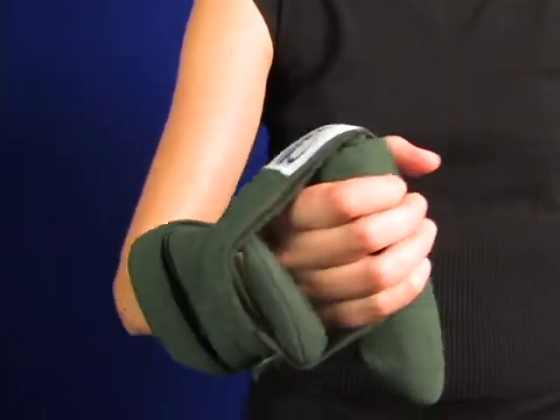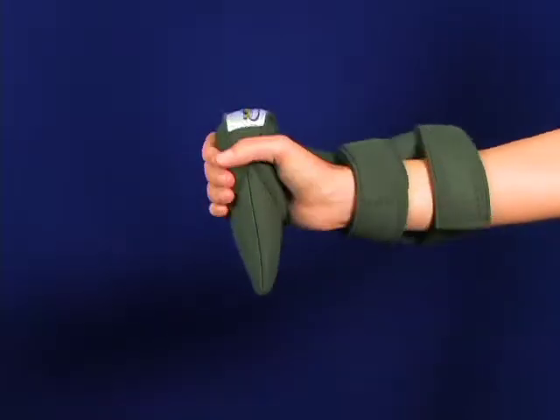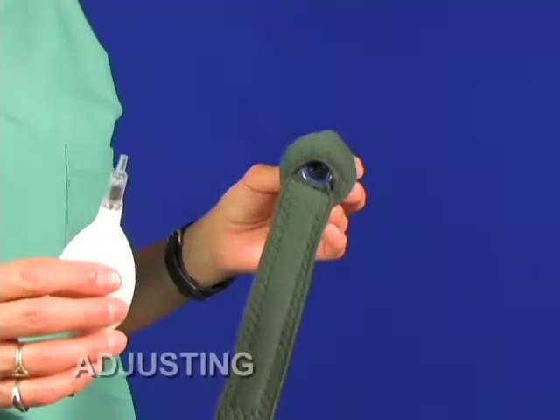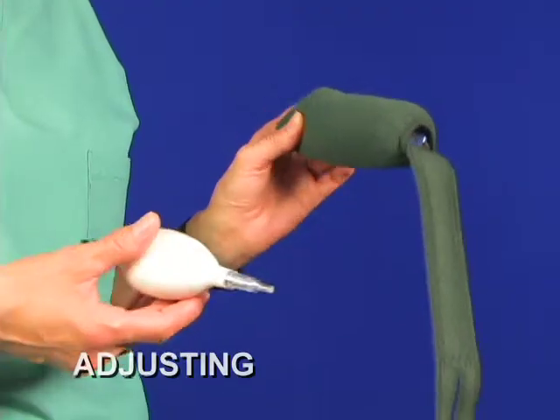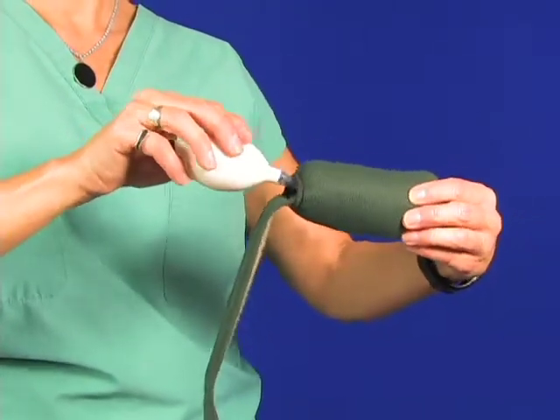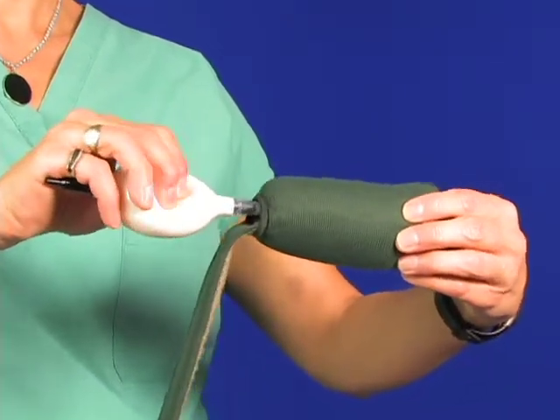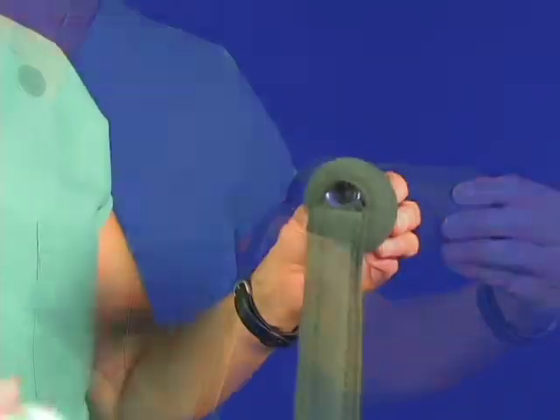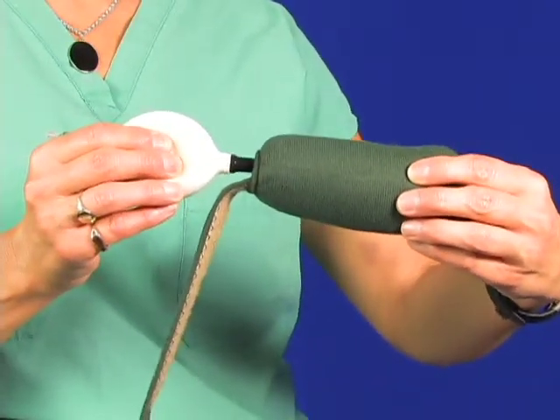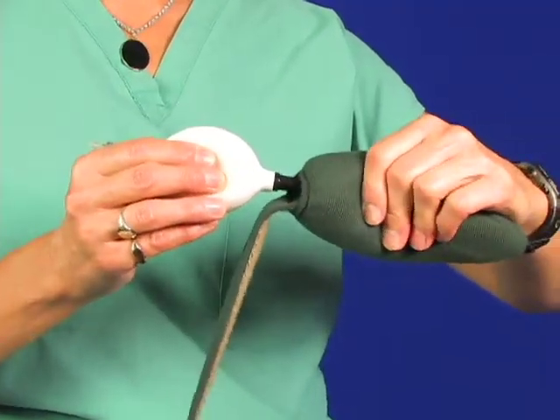The gripping hand splint with the multiple rolls is sort of the next step after this — this is for pretty severely contracted hands. Here you have the carrot bulb; you can see the pump. One side pumps air — you've got to just push it in slightly to open the valve on the carrot. Pump it up with air as much as you want, then you can take it out. Push in the other end to squeeze the carrot and evacuate the air. That's how you adjust that.